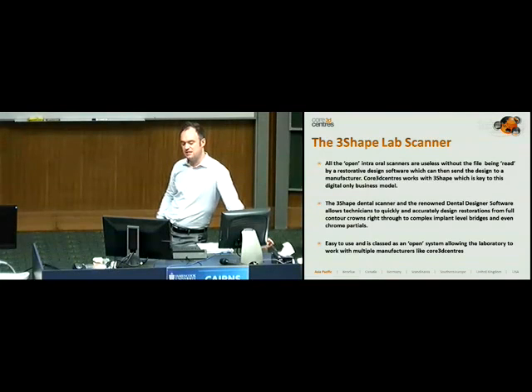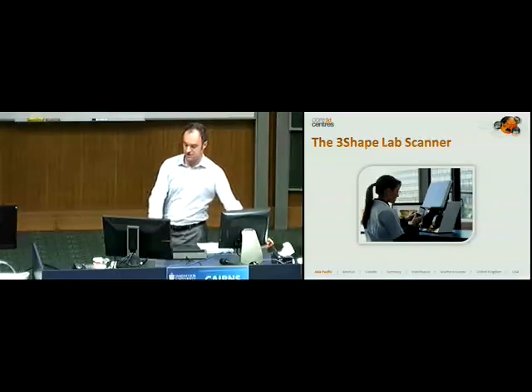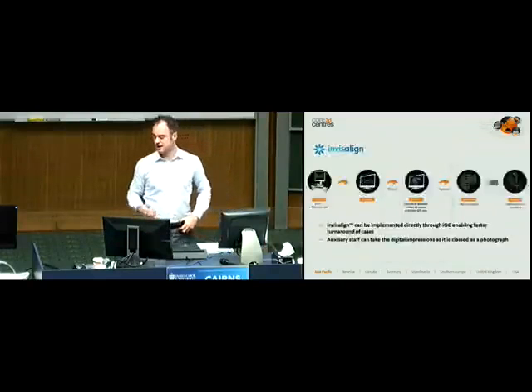You really need someone to send it to, whether it's the physical model itself or whether it's a laboratory with the right open scanner that can accept these files. And that's the key: can your lab accept the files? And this is what it looks like. It's just a small box, just big enough for a model. The door closes and it scans. It takes about 5 or 6 minutes to scan a model. But of course, if you've already scanned the patient with an intraoral scanner, the data's already ready to go, which is kind of nice.